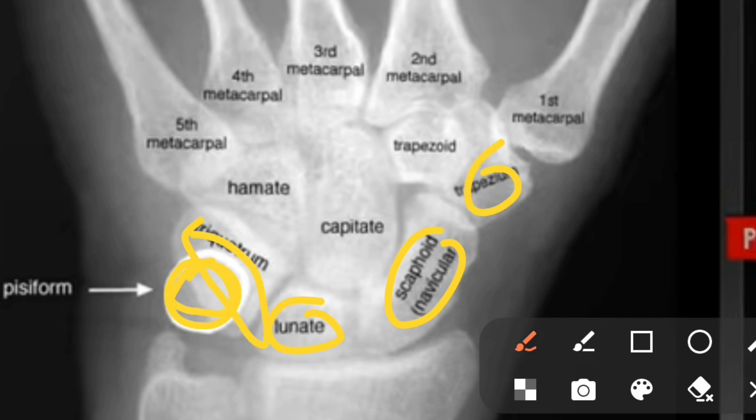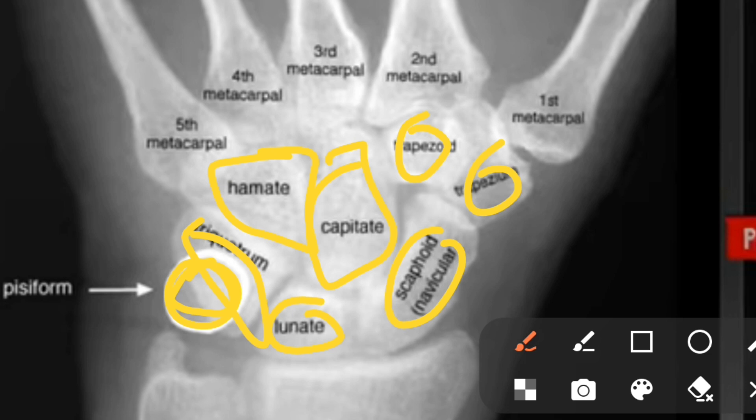The carpal bones are: trapezium, trapezoid, capitate, hamate — okay — and scaphoid, lunate, triquetral, pisiform, trapezium, trapezoid, capitate, hamate. Then the lower end of the metacarpals.